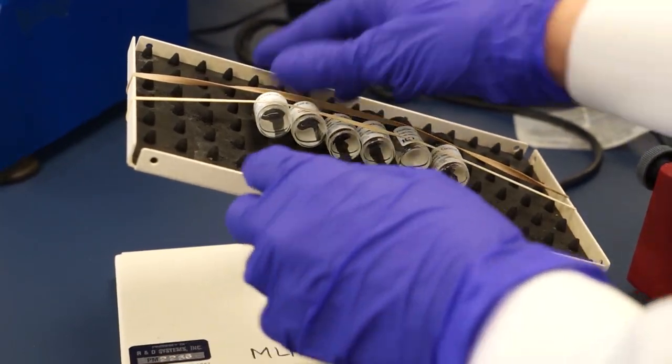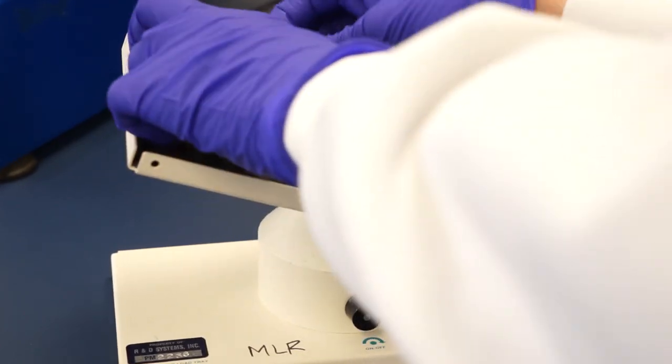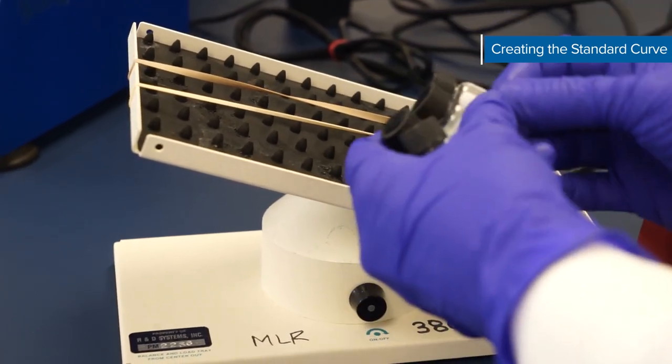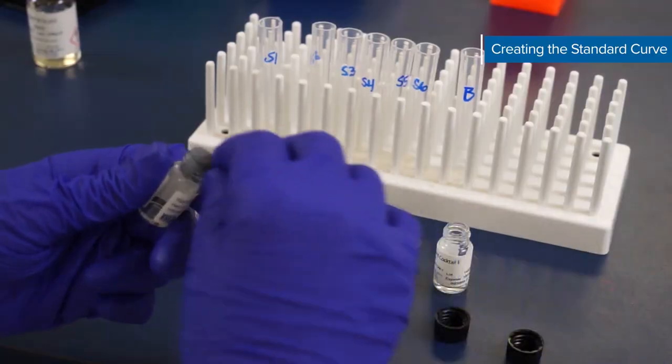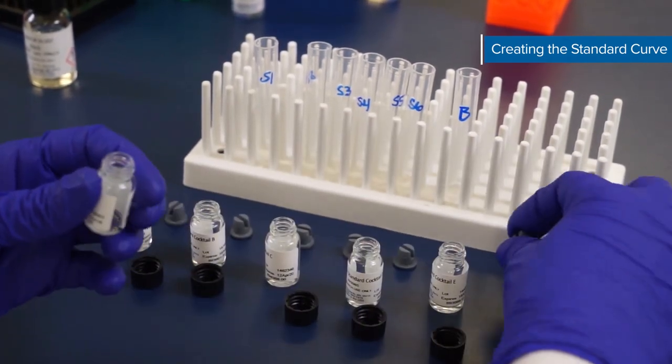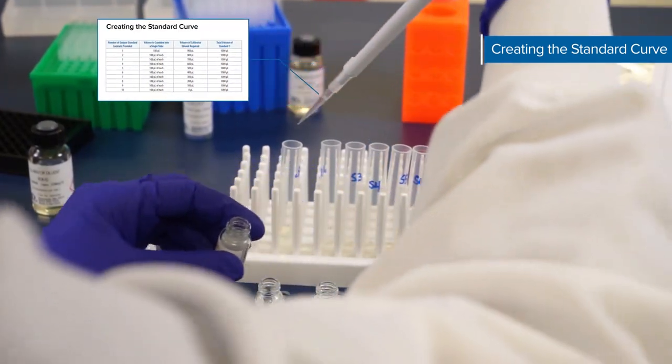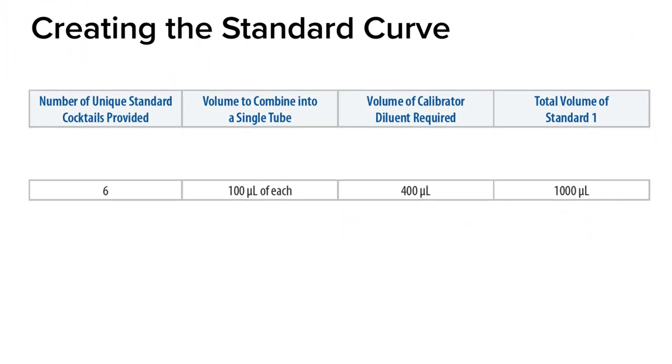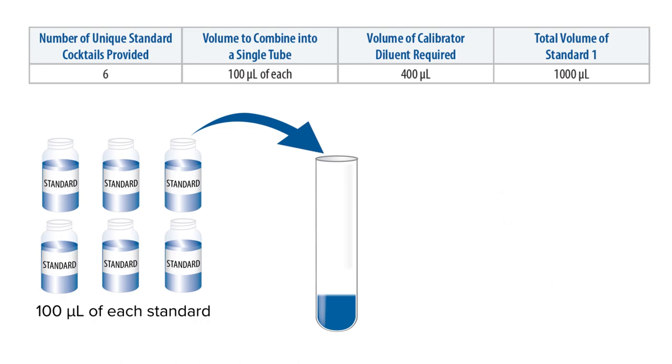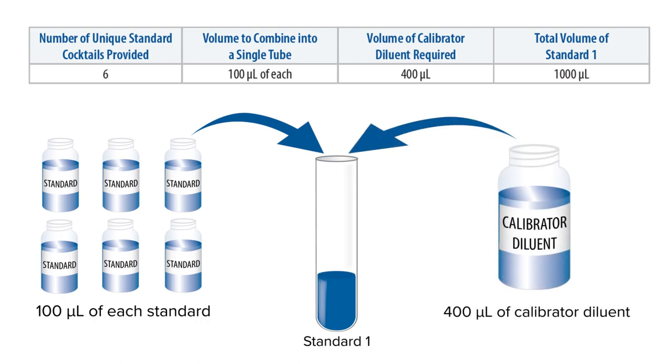About 15 minutes should have passed since you reconstituted your standard cocktail. Once reconstituted, each standard cocktail is a 10x concentrate. Use polypropylene tubes to combine the unique standard cocktails with the calibrator diluent according to your kit booklet to create standard one. In this video we're using six unique standard cocktails, so we'll add 100 microliters of each standard to 400 microliters of calibrator diluent to make a total volume of 1000 microliters. Vortex gently to mix.